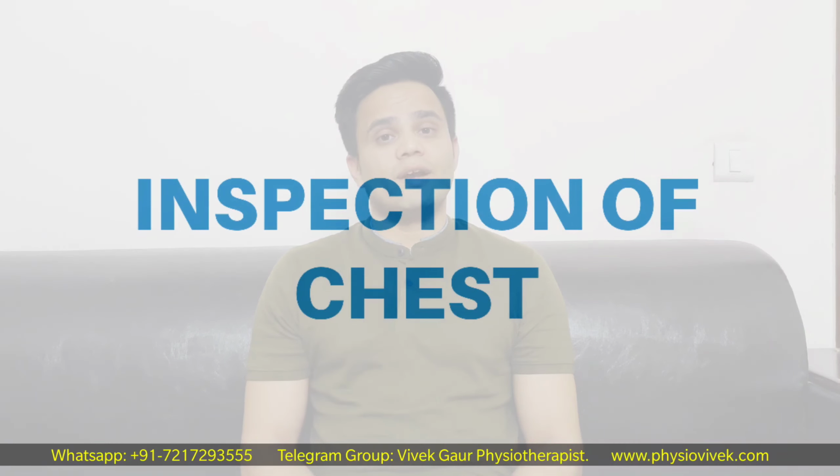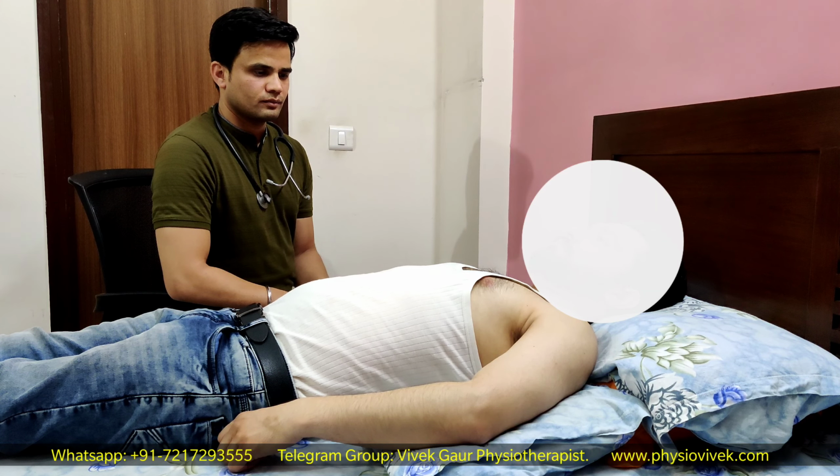The first part is where we ask the patient to lie down supine in decubitus position. In this position, the patient has to lie down supine on his back with his head and shoulders lifted 30 to 40 degrees up. Once your patient has undressed and you have made them lie supine on their back, then the examination of the chest starts. The first step, even before auscultation, is inspection of the chest. So just by having a look at the chest wall, you see any visible abnormality that might be associated with a cardiac problem as well.